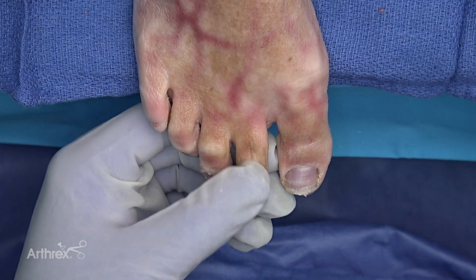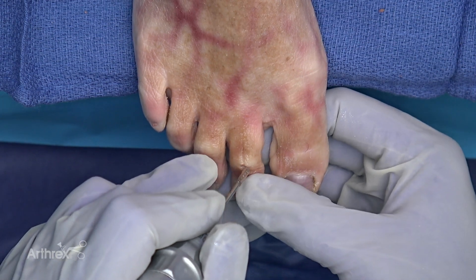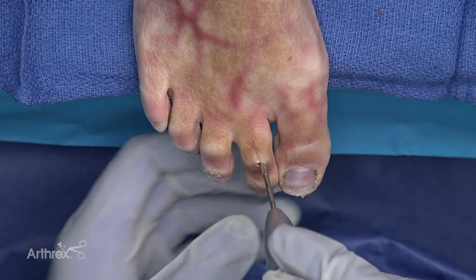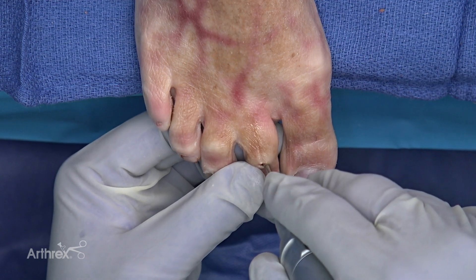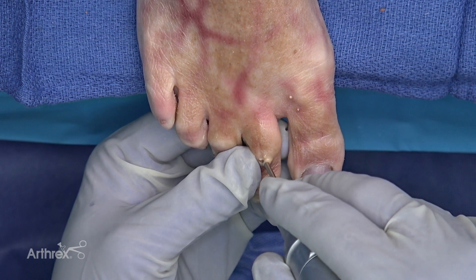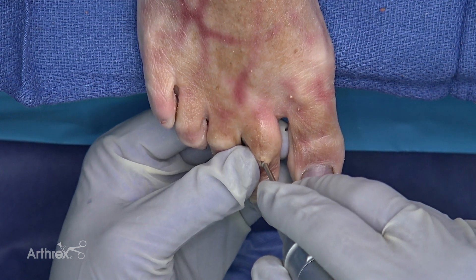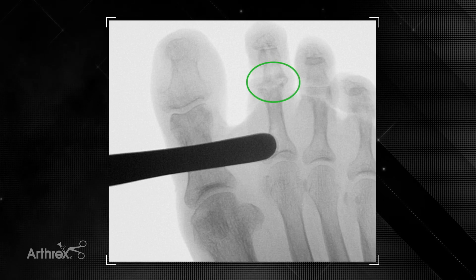If you recall we had a little bit of excessive bone on the lateral side of the proximal phalanx, so we're going to preferentially remove a little bone there. I can literally hear and feel when the appropriate amount of bone is removed. We can see now that the joint is appropriately prepared.